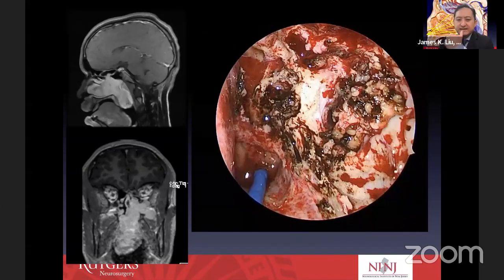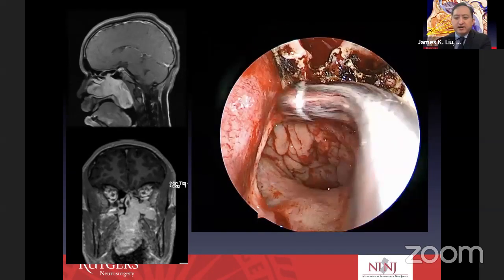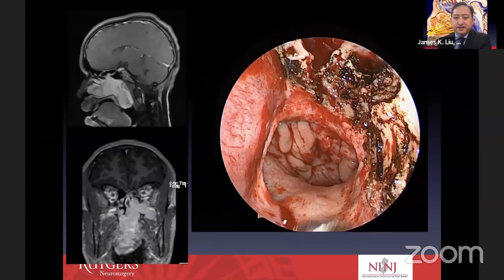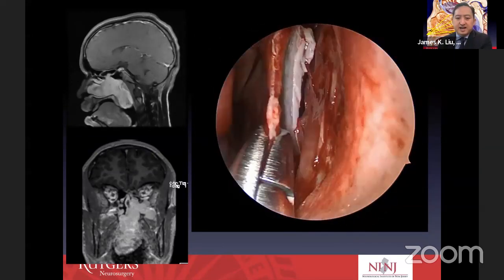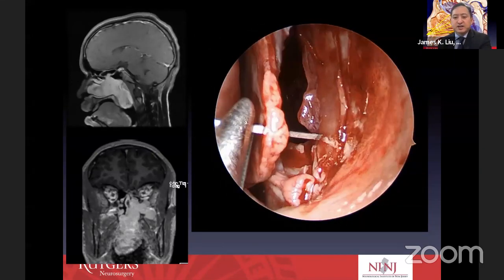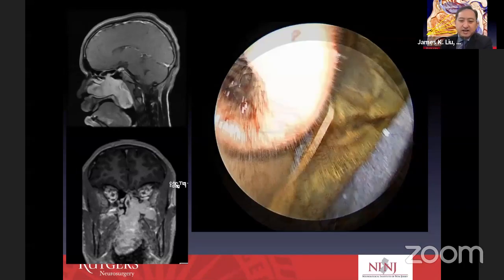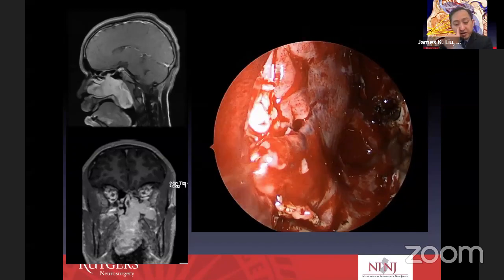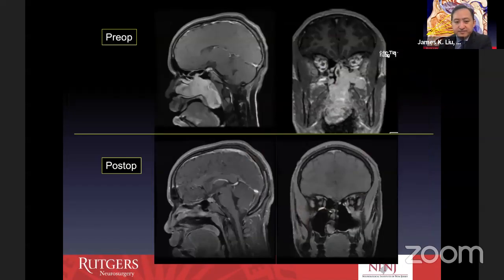And that's a nice strategy. Here's the infratemporal fossa, resection bed. There's the oropharynx, nasopharynx. And we can put the septum back and suture the nasal mucosa using a straight needle in a quilted-like pattern. And this gives you a nice repair of the nasal septum and so forth. So here's the post-op scan, complete removal of this large JNA.